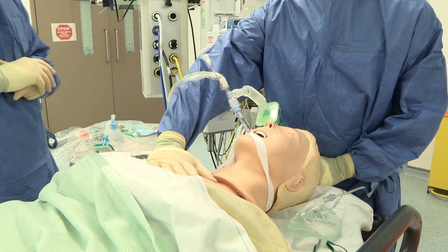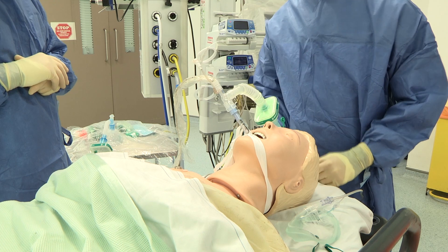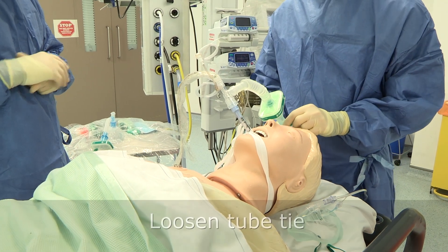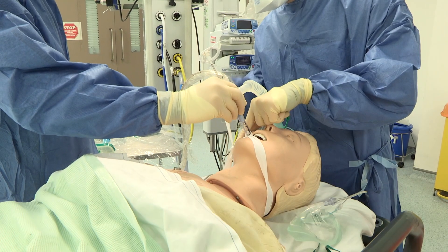He's breathing well, minimal secretions — no reason to suction again. James, can I actually just support the tube while I do the tie? Supporting the tube.